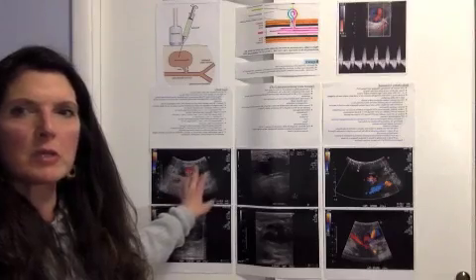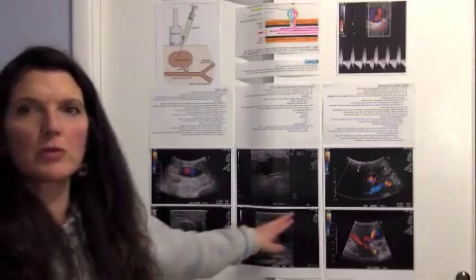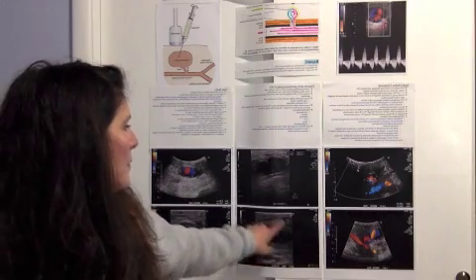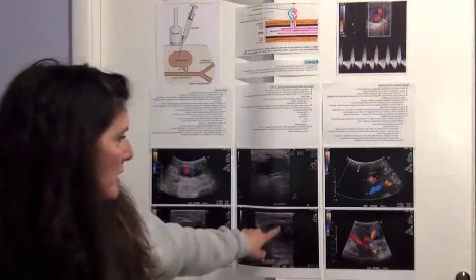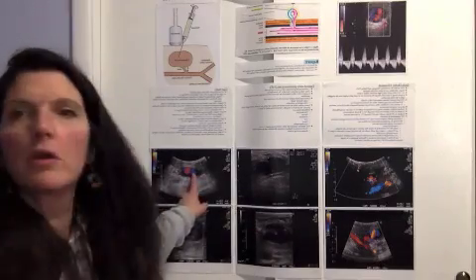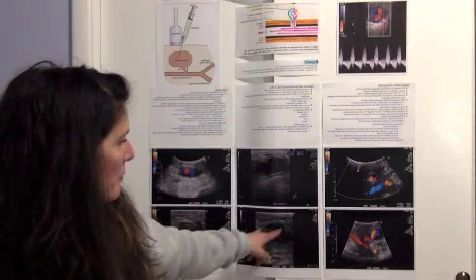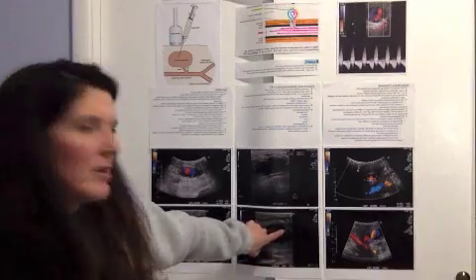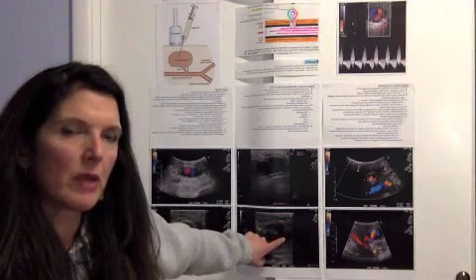In that case, we decided to treat it, and we used ultrasound guided thrombin injection. The vascular surgeon injected the lumen portion of the larger lobe of the pseudoaneurysm, and we did that with B mode as explained earlier. In this picture, you can barely see it because it's far away in this video, but there's the needle right there.